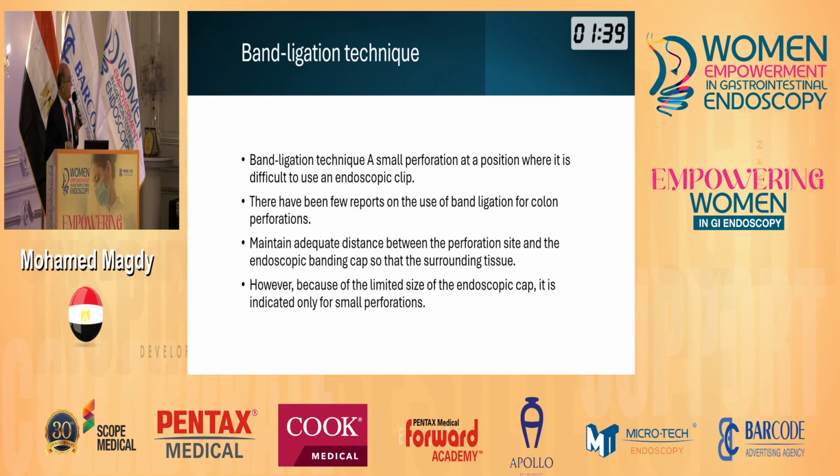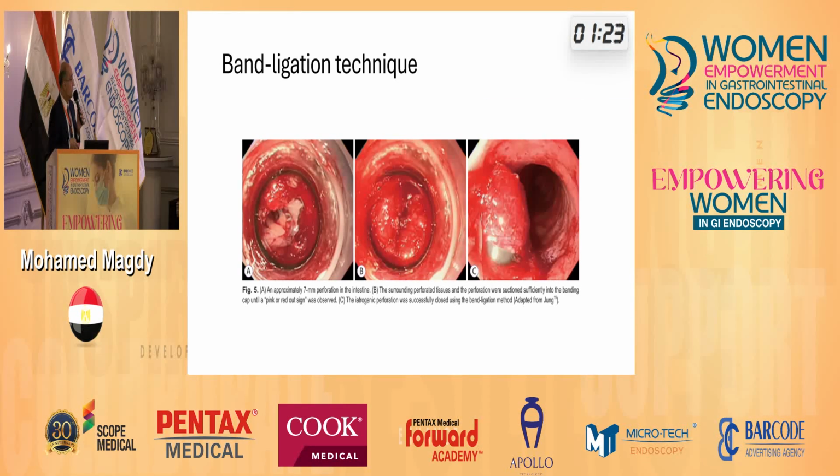Band ligation is described in some literature and has been used when the clips are difficult to introduce, and also for very small perforations, you can use this band ligation.